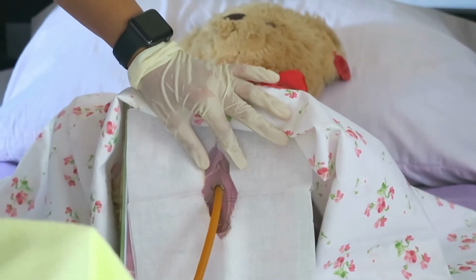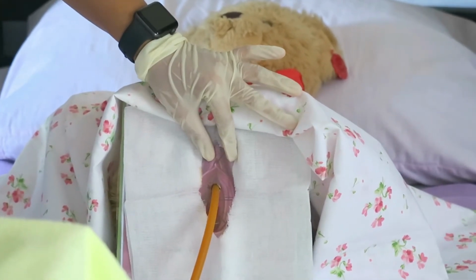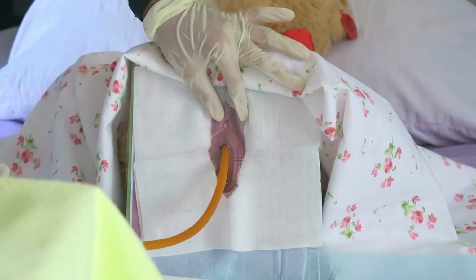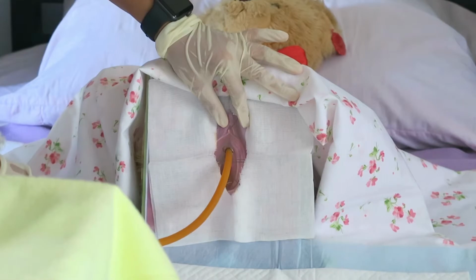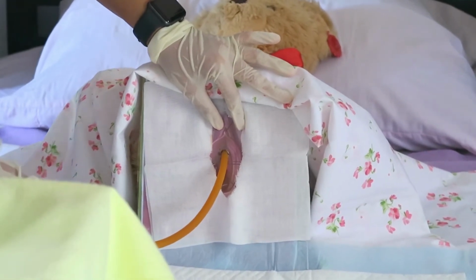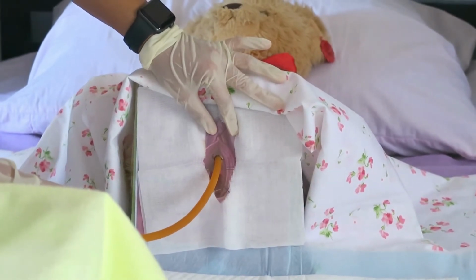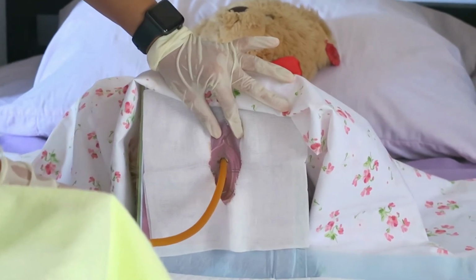Then after that, press the hand in the pubis area while holding the catheter in place. The catheter to prevent pulling and pushing of the catheter to ensure placement in the bladder and facilitates inflation of the balloon without damaging the urethra. So bladder or sphincter contraction could push the catheter. So after that, connect the catheter to the urine bag and be sure the bag is closed and keep the connection sterile so that the urine will not leak from the bag and maintaining sterility.